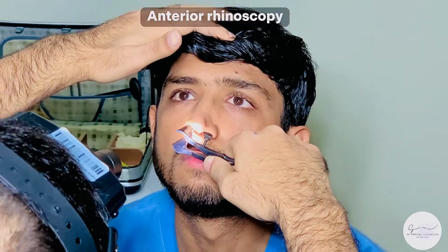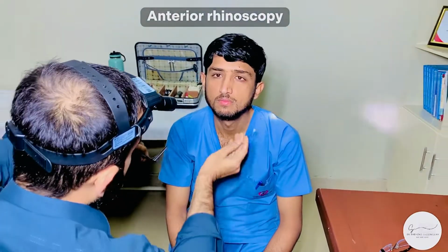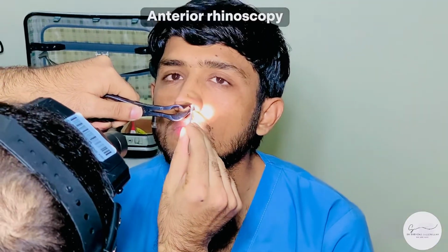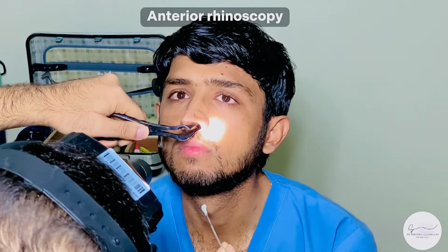If during this step you see any secretions building up inside the nose, what you will do is take a cotton swab and gently clear off the secretions. In order to do that, I have to hold the speculum in my non-dominant hand, and with my dominant hand, I'm going to be cleaning off any secretions or any discharge so that I can have a good view inside the nose.